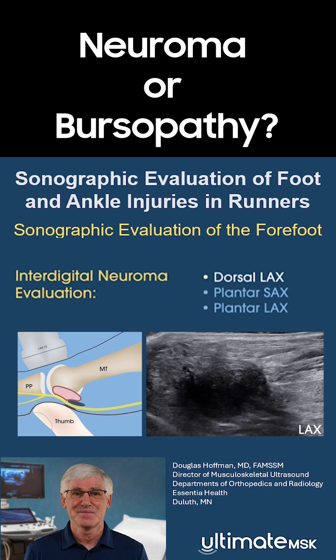An advantage of the dorsal approach is that it allows visualization of the full contents of the interspace. By applying dorsally directed thumb pressure from the plantar side, the contents of the interspace are displaced dorsally, bringing them closer to the transducer.